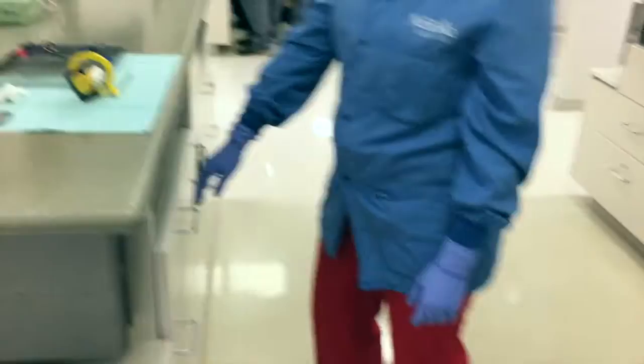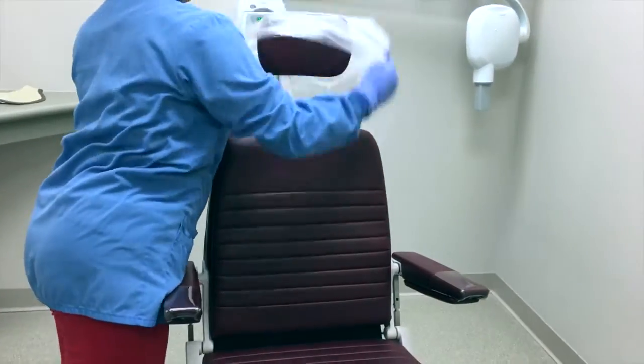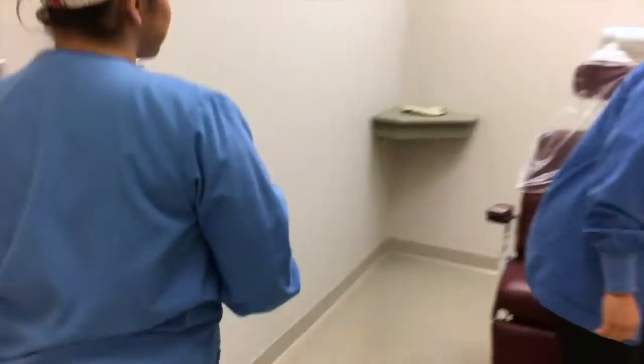The clinician will then set the chair up appropriately, making sure to bag the headrest. The patient will then sit in the chair and the clinician will put the thyroid collar on them.